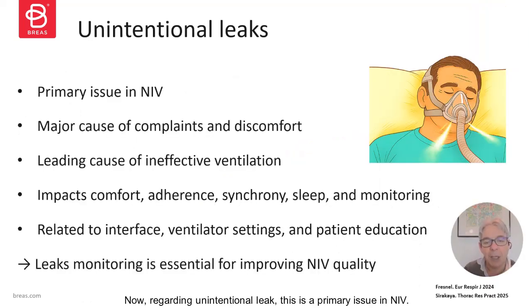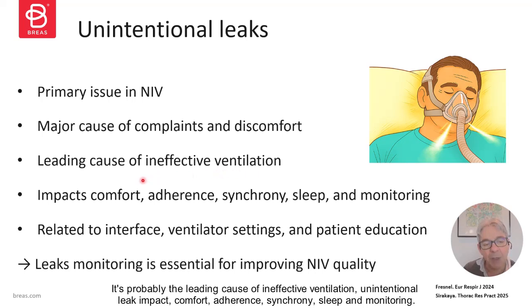Now, regarding unintentional leak, this is the primary issue in NIV. It's a major cause of complaints and discomfort from the patient. It's probably the leading cause of ineffective ventilation. Unintentional leak impacts comfort, adherence, synchrony, sleep, and monitoring.